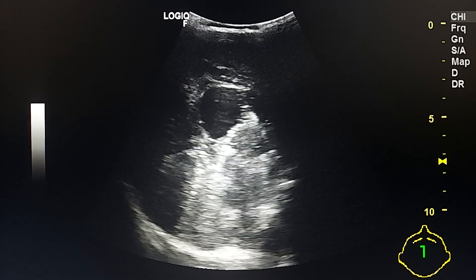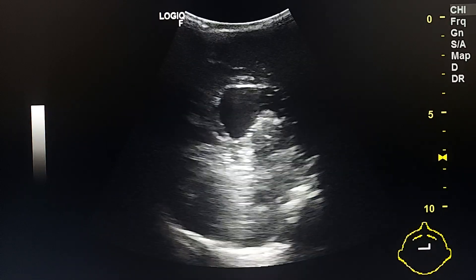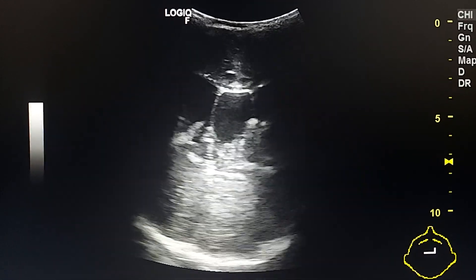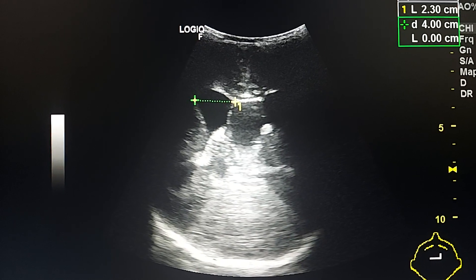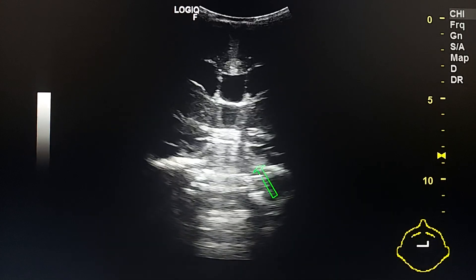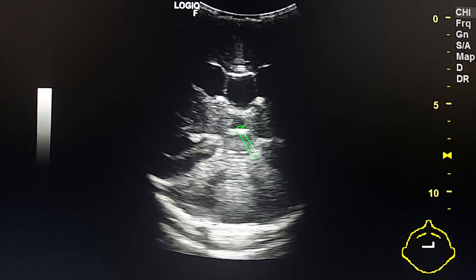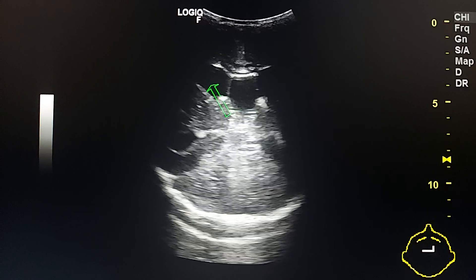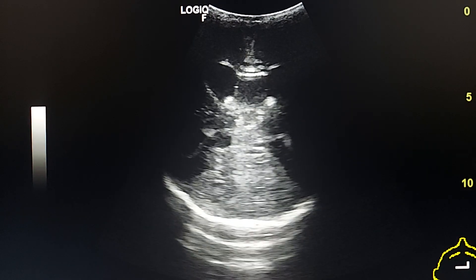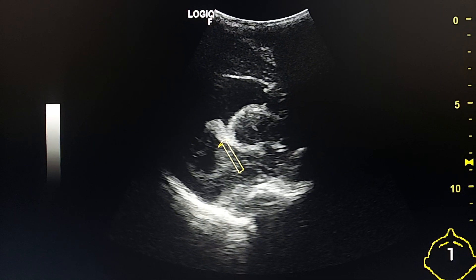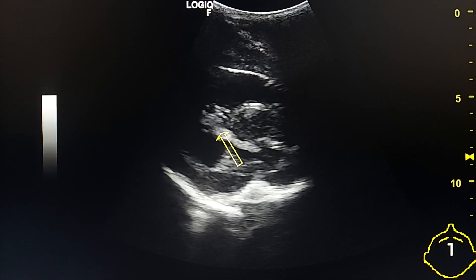Sagittal section. The child is six months old. Here we see that the cerebellum is normal. This is the cavum septum pellucidum and this is the third ventricle. This is a sagittal section; we see the choroid plexus in the lateral ventricle.